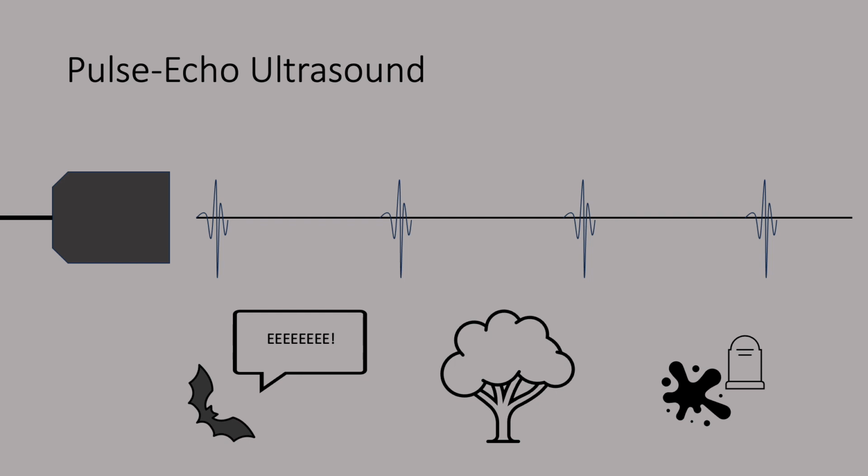But as a basic rule to understand, pulse echo ultrasound means that we emit a pulse, we then wait for those echoes to come back, and then we emit another pulse. And we can change some things on the machine to change the distance and the time it takes between those pulses or how strong those pulses are and all that stuff. But really, that's beyond the scope of what I expect you all to know.